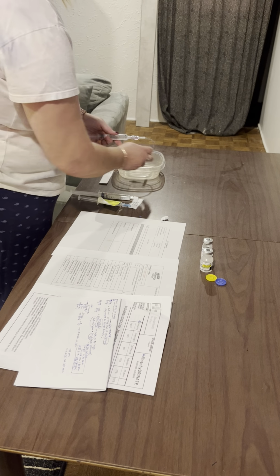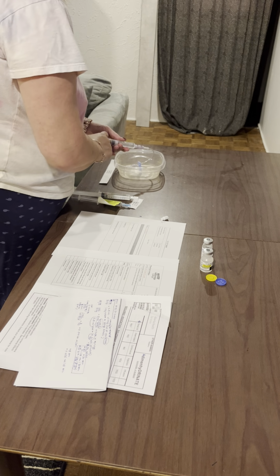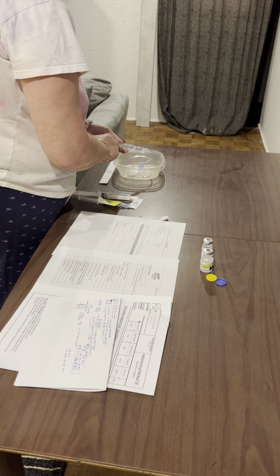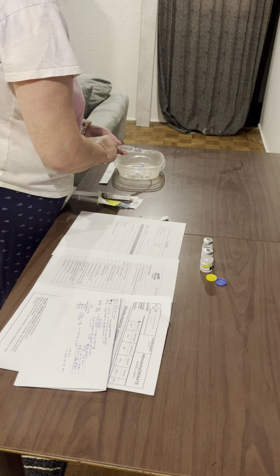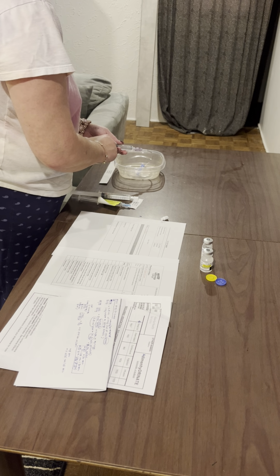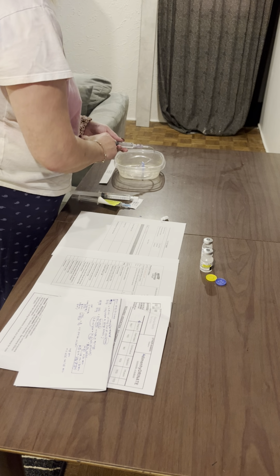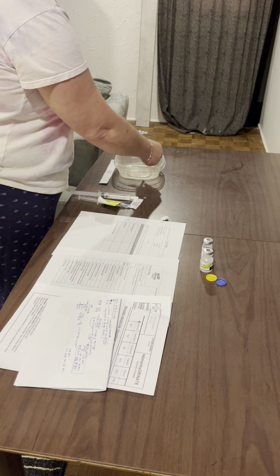Again, we're maintaining sterility and we have gloves here. And then what we would do is just flush it through. We would watch the site to make sure that, again, there's no coldness, edema, puffiness. The patient doesn't complain of anything like that happening. And we can see the site is patent. So we're good there.